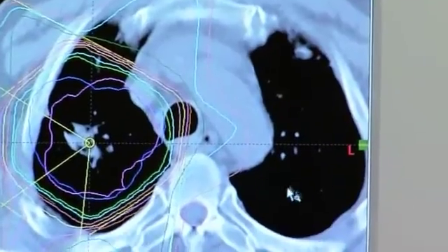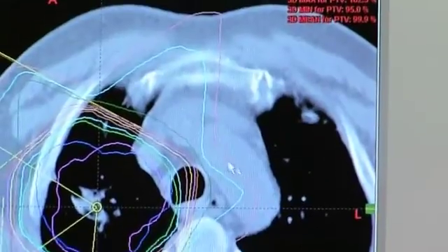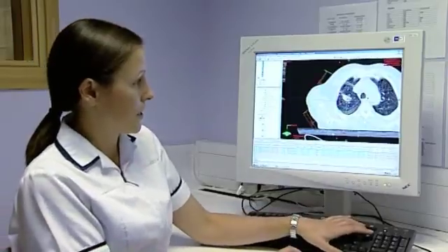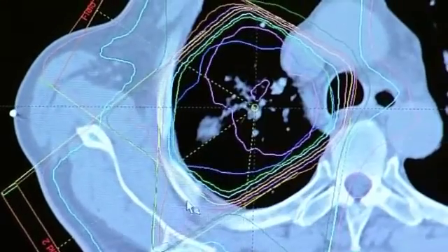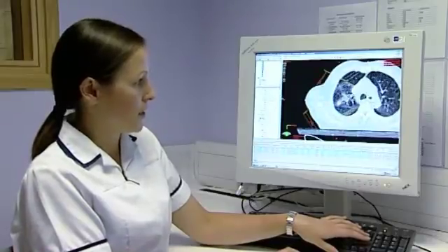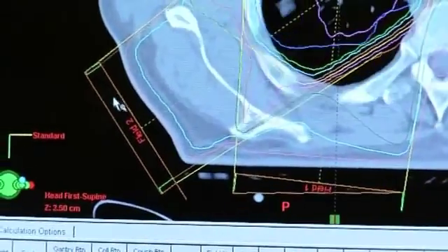The dose to the left lung is also reduced, and only 30% is received in the pericardium and mediastinum. As we scroll through the distribution, we can see that we've got a homogenous dose distribution, and we achieve that by applying a wedge in the superior and inferior direction.